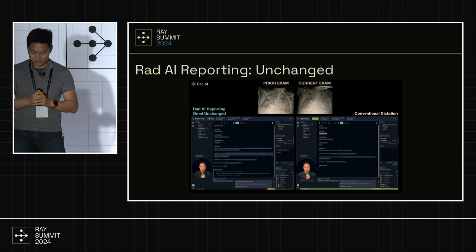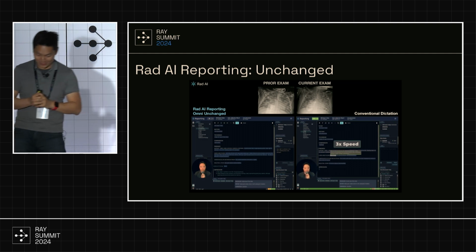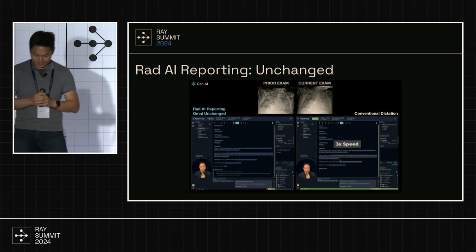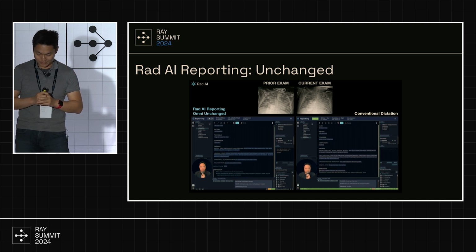Field comparison, 10/31/23. Field support lines. New right IJ catheter is in the SVC, period. A feeding tube is in the stomach, period. This is going to take a long time. I didn't want to make everyone have to sit through this, so 3xing here. Although superimposed pneumonia cannot be ruled out, period.